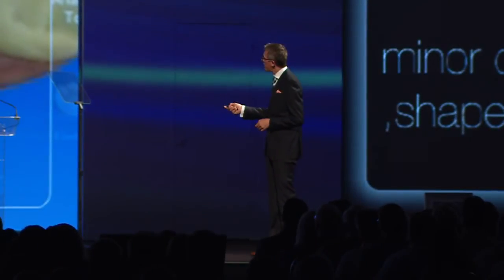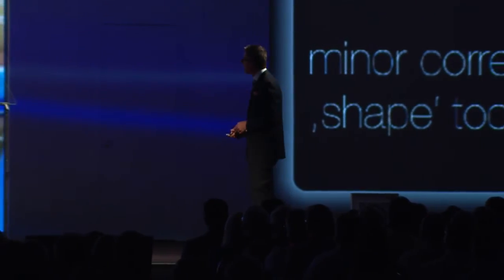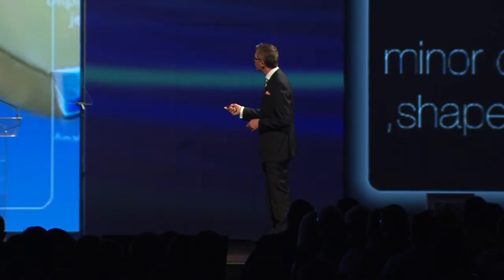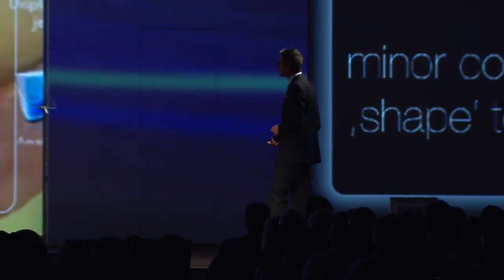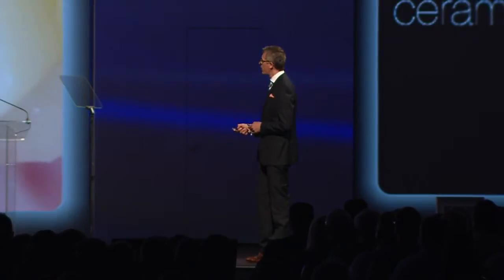Here you see we have a very nice proposal. Just some minor corrections have to be done. We have all these tools with the 4.0 software in order to make these minor corrections with the shape of our crown. And then we can machine our restoration. And again, we can do the try-in.